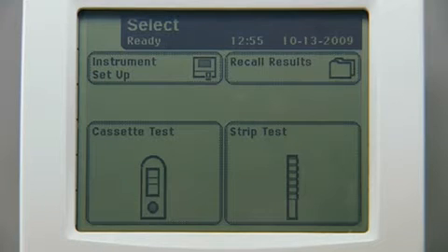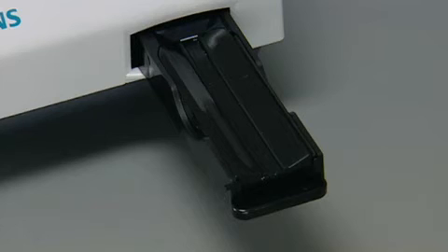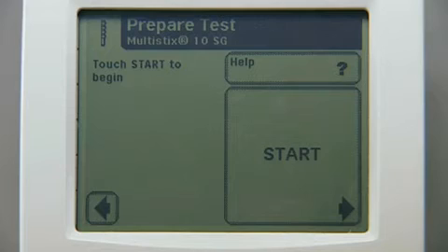From the main select screen touch strip test to access the prepare test screen. Verify that the test table inset is positioned with the reagent strip holder facing upward. Touch the start button.